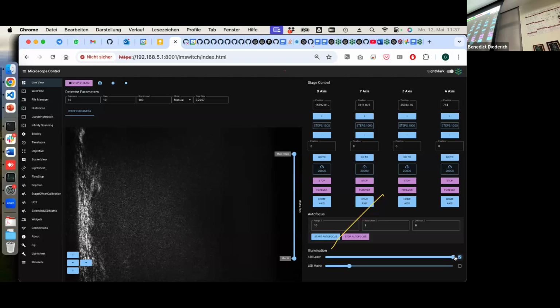So you're reflecting one portion of the light, and then you have a reference wave, in that case wave 1, for example. And then they look into the depths of the eye so that they can project the 3D structure of the eye and see whether you have a cataract or something like that. It's called OCT, optical coherence tomography.